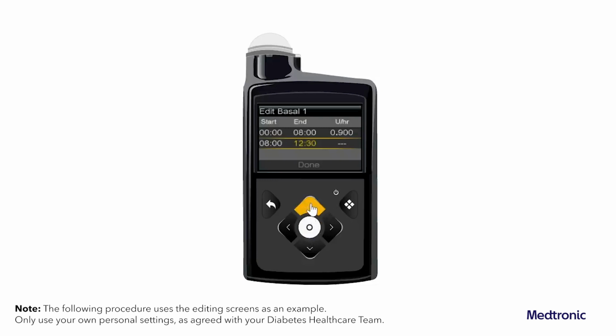Enter the end time for the next time period. Enter the unit value for the next time period. Press Select.